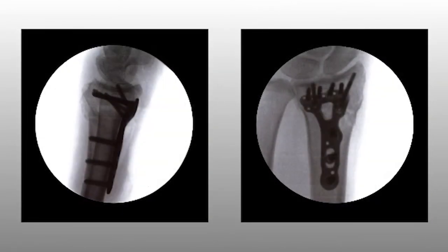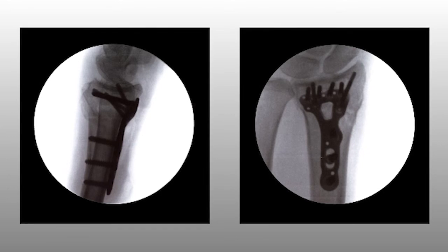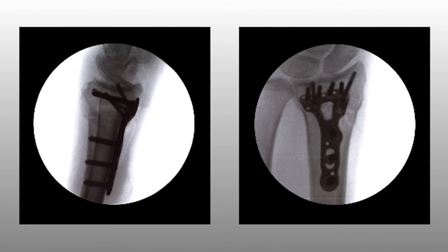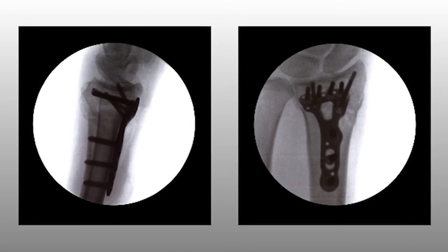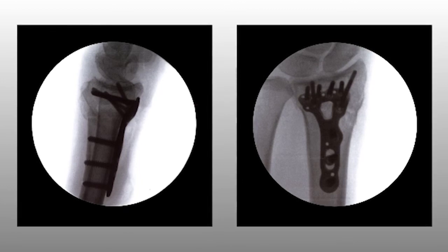Perform a thorough radiographic evaluation, checking fragment reduction, alignment, and screw placement. Verify that there is not a gap between the bone and the plate in the lateral view, and that the distal screws have not penetrated the radiocarpal joint. Close the wound and support the wrist according to bone quality and stability. Allow for early functional use of the hand and start immediate finger range of motion and forearm rotation post-operatively.